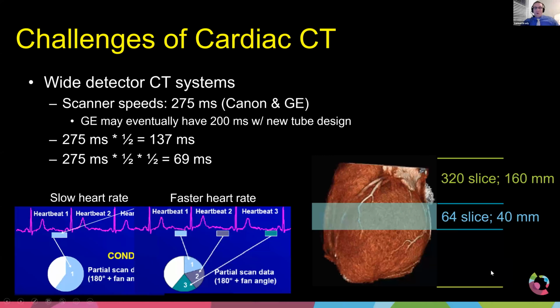So these wide angle scanners and the high pitch turbo flash dual source CT scanners can basically image the heart with the exact same speed. One just has to do it twice. The other one just has to go real fast.